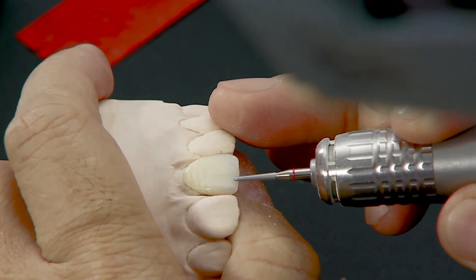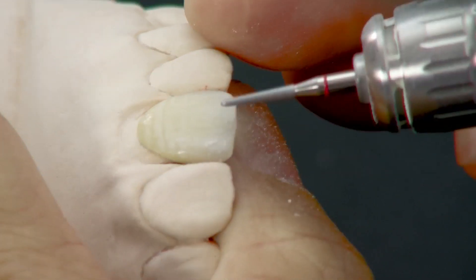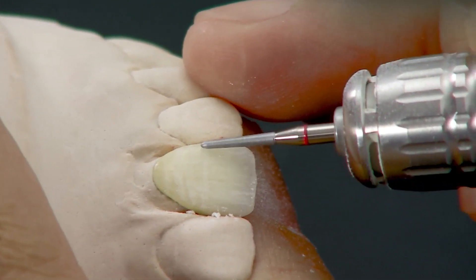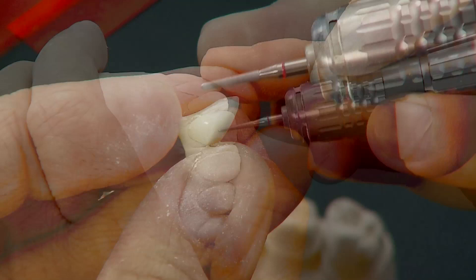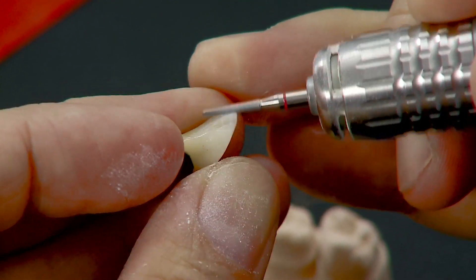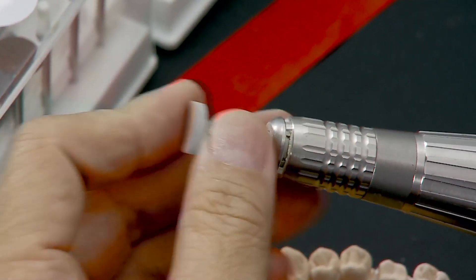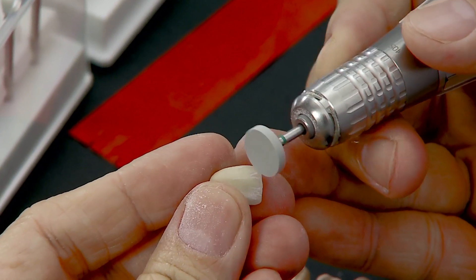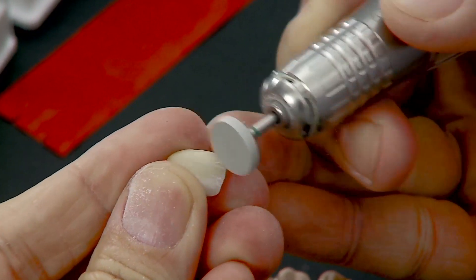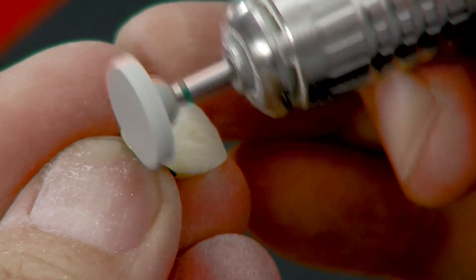Further enhance characteristics such as the perikymata and mamelons on the crown surface with a fine diamond point HP. Use the same point to adjust the palatal surface. After contouring, do the fine finishing of the whole crown with an impregnated silicone polisher Soft Cut PA.